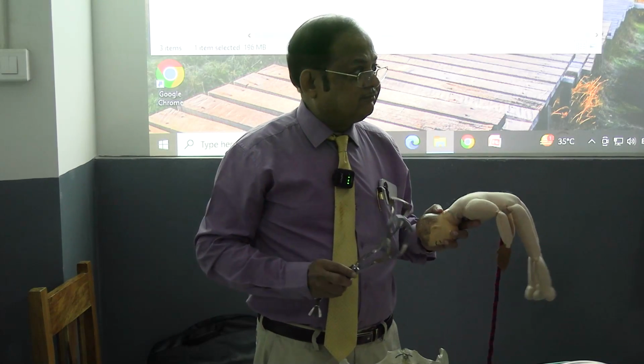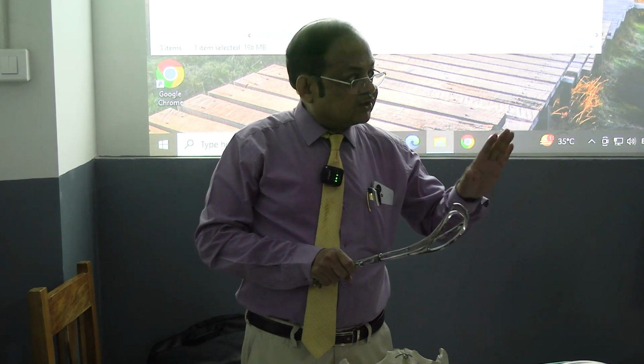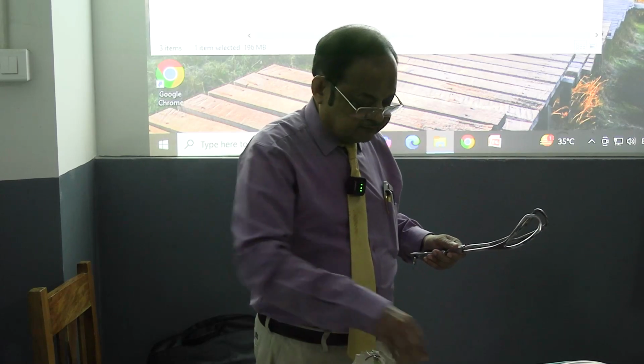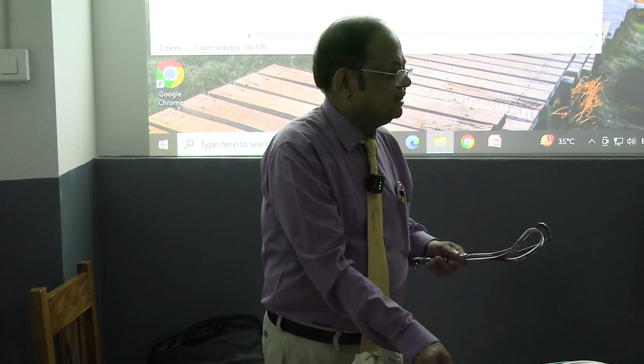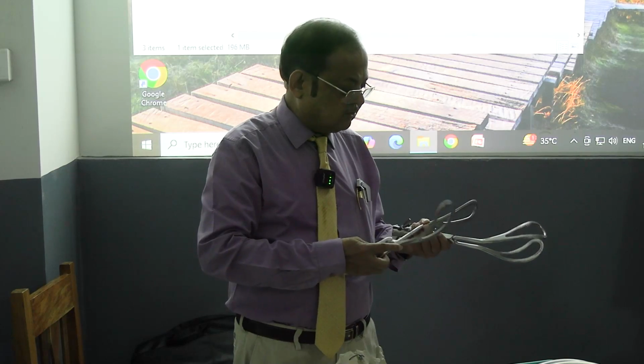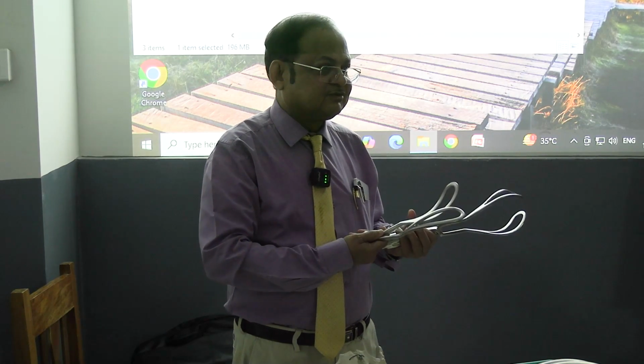And this is regarding the forceps types and different parts, but the forceps operation is separate. You can say short obstetric forceps, long obstetric forceps. You see frequently, many of your seniors use this short curved obstetric forceps, this is the outlet forceps. It is commonly used for the outlet forceps operation.